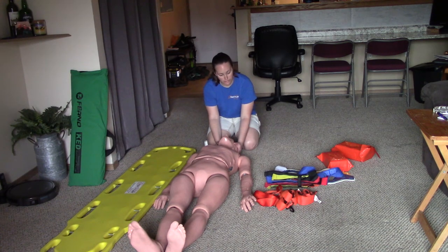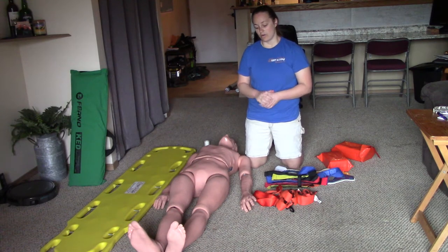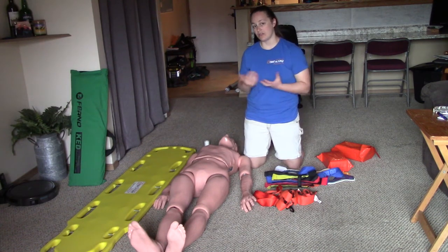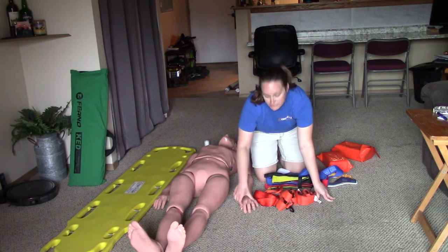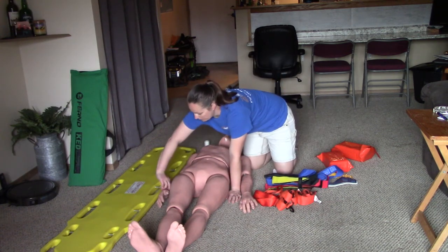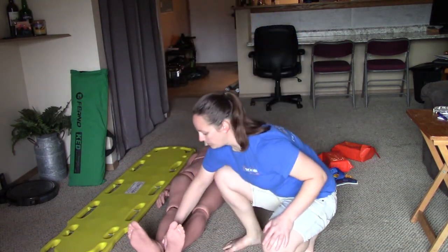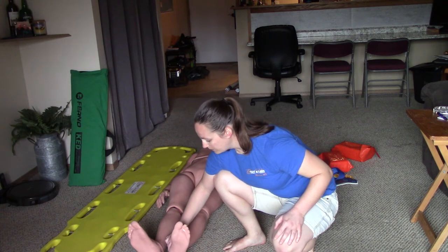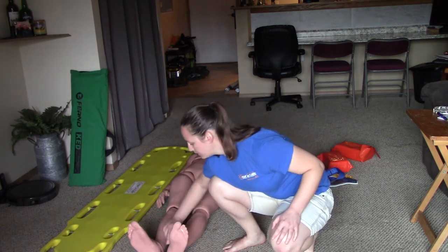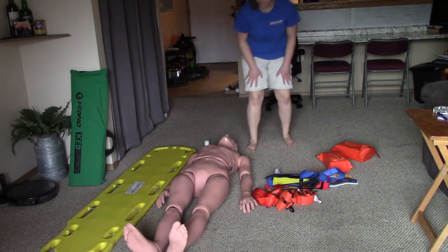With my imaginary partner holding c-spine, I'm going to check circulation, sensation, and motor in all four extremities. Circulation means checking a pulse; sensation means asking the patient if they can feel you touching them; and motor means asking them to squeeze your hand. I'll check for a pulse, ask which finger I'm grabbing, and ask them to squeeze my hand — doing that on all four extremities, including checking the posterior tibial pulse just behind the ankle bone on the feet, asking which toe I'm grabbing, and can you wiggle your foot.